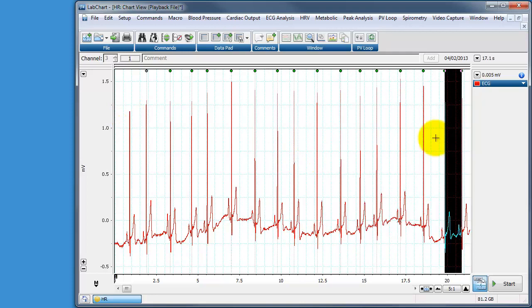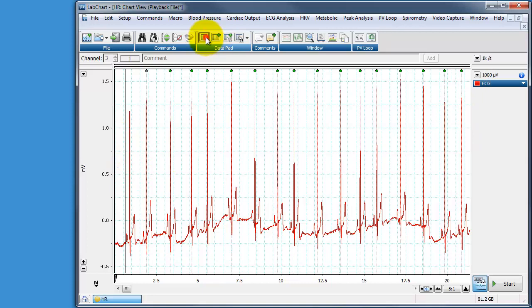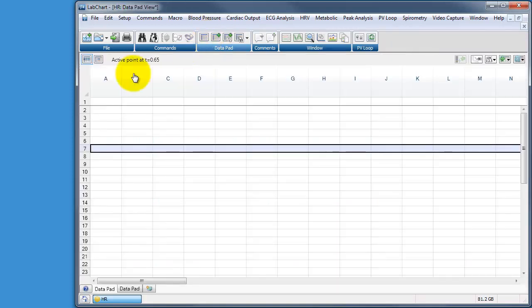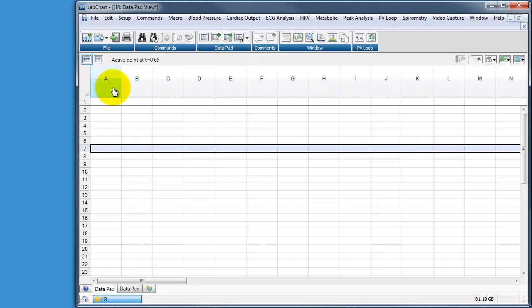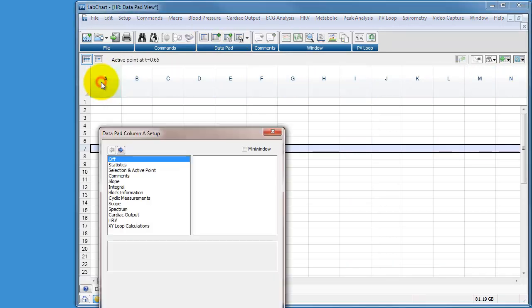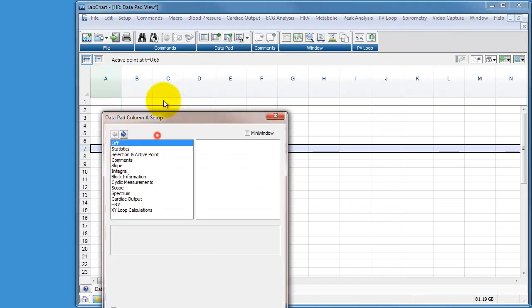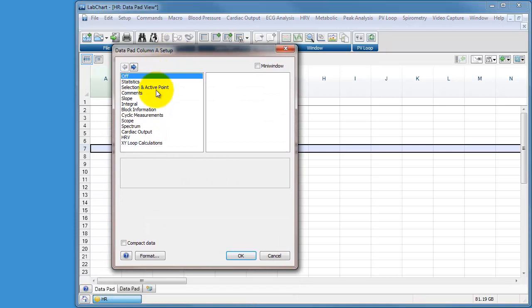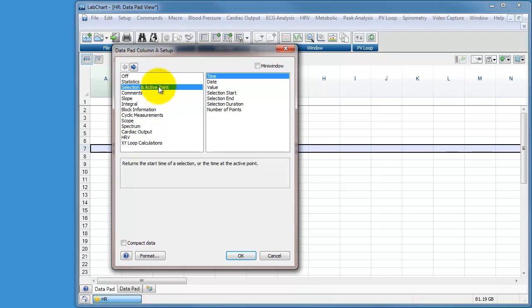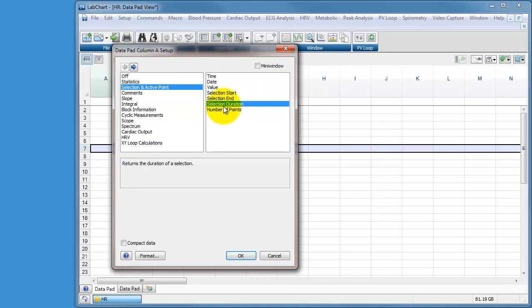We want to be able to now add this distance, the time it takes from this R wave to the next R wave, we want to add that to our data pad. So the first thing we need to do is go to our data pad and make sure the channels are set up correctly. At the moment there are no channels set up. So channel A, I want to choose Selection and Active Point and I want to choose Selection Duration. So in this case the data that are selected, I want to add the duration of that selection and I want to add that to the data pad in seconds.